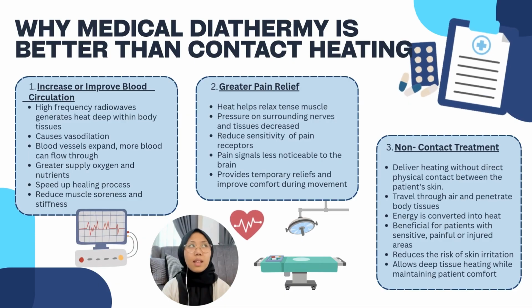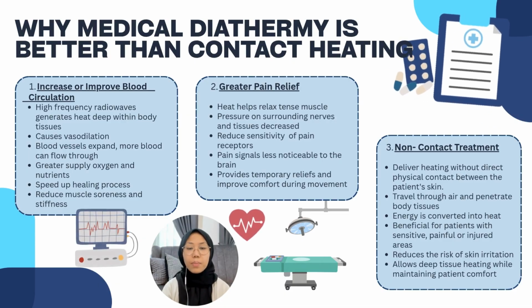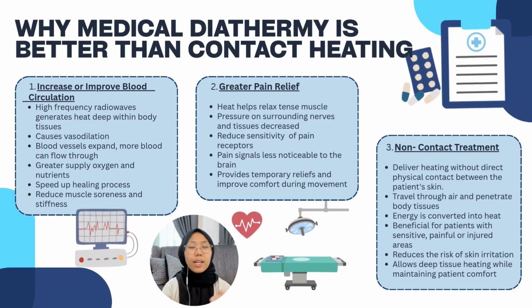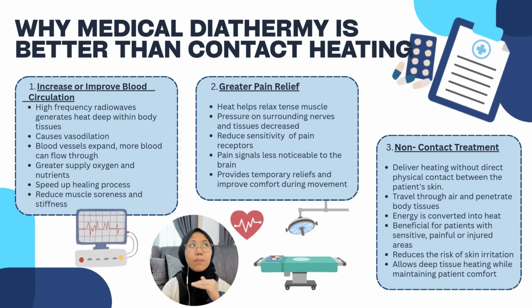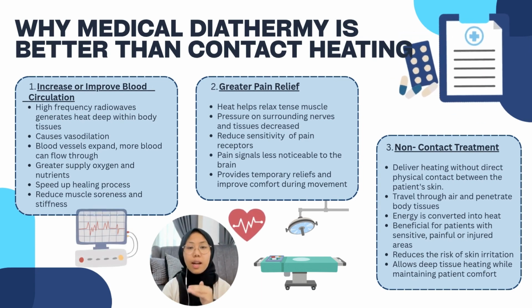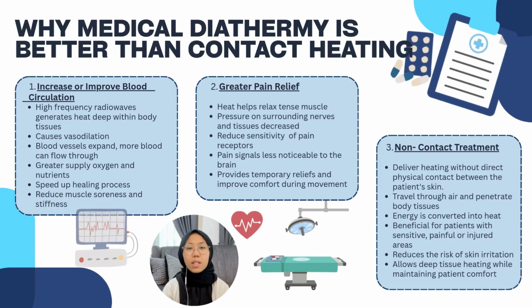Lastly, diathermy is a non-contact treatment. Unlike contact heating, it does not require direct contact with the patient's skin. The radio waves travel through the air and penetrate the body tissue, where the energy is converted into heat. This also makes it especially suitable for patients with sensitive, painful, or injured areas, as it reduces the risk of skin irritation while providing effective deep tissue heating.